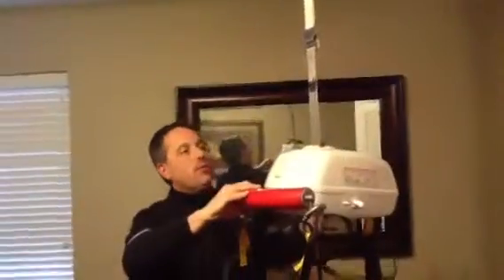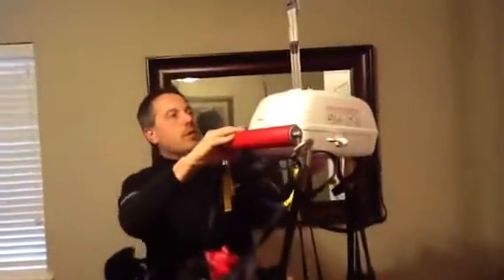I want to start and raise her up to where we see this black sewn-over portion right here, and I'm going to bring her to the opening in the doorway where we're centered. Then I'm going to pull out the non-weight-bearing strap, and I have to install it at this severe angle — that's its own safety feature so this belt just can't jump out of the distance strap.